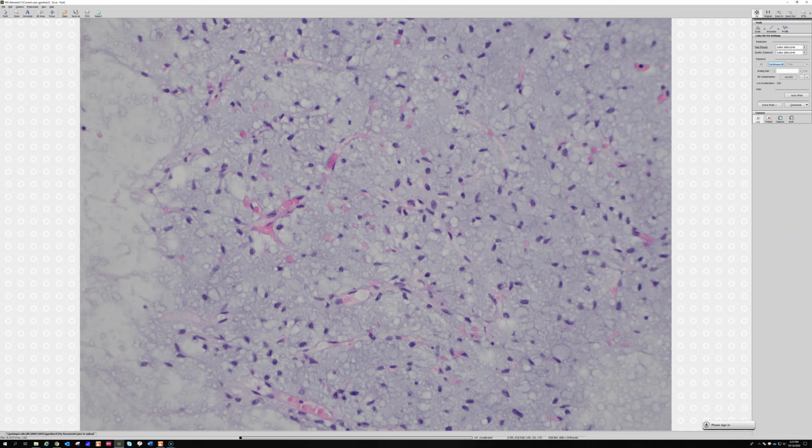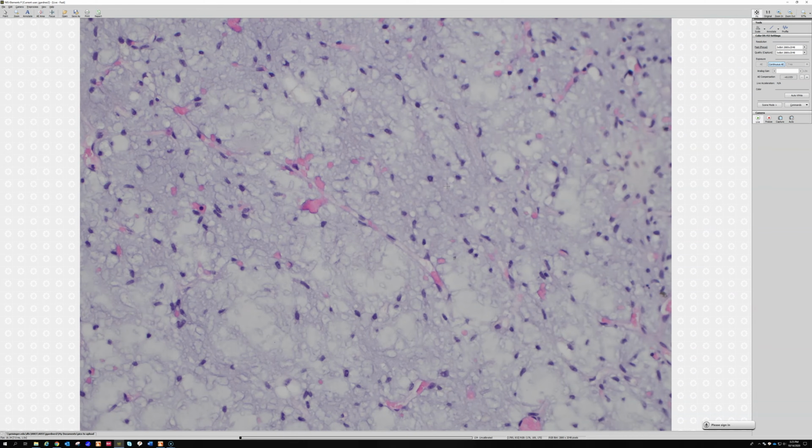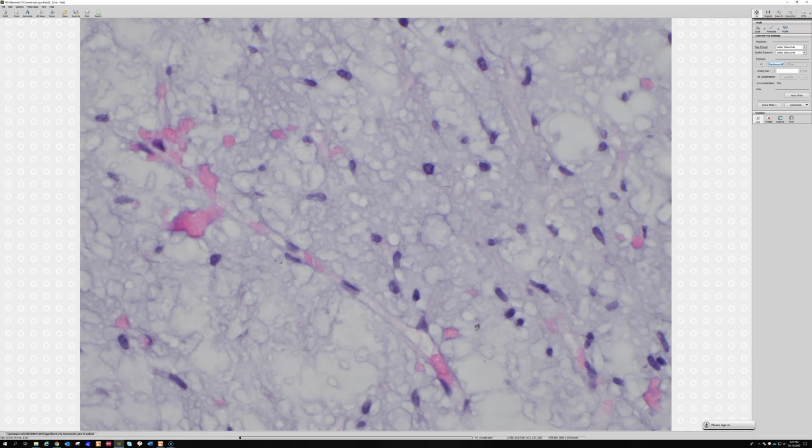So this is in the muscle, though, of a young adult, and has very delicate, very fine vessels. Look how subtle, and let me find a better area. This slide is a little old and faded, but it's still a pretty good example. Look at this. This vessel is about the tiniest, thinnest little vessel. You can't make a vessel smaller than that. Look, it's one endothelial cell thick, and it only has room for single red cells. You remember rouleaux formation in multiple myeloma, like a stack of coins? The red cells are almost making rouleaux formation going through. They can only go single file through the vessel.